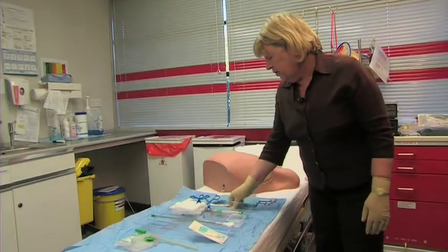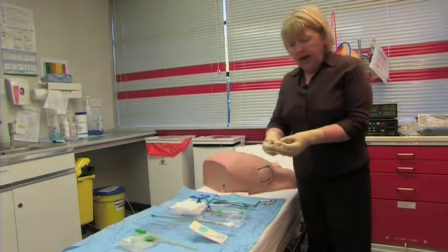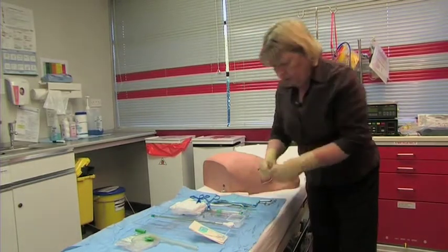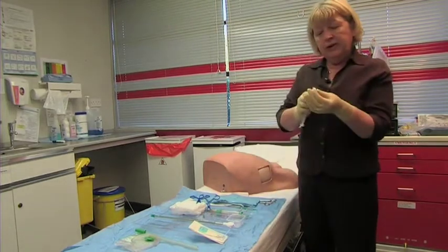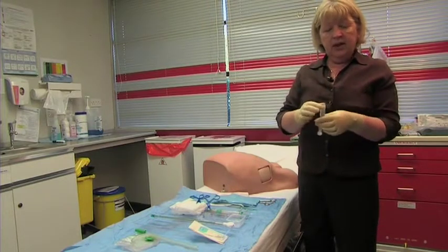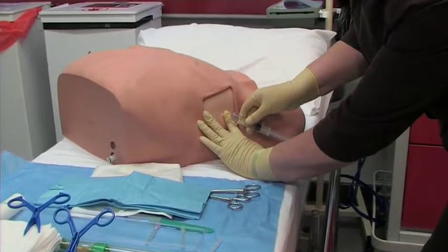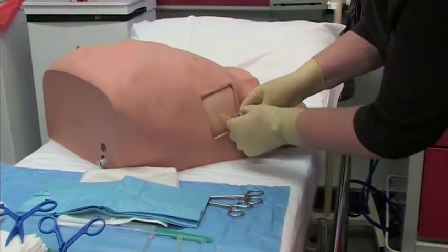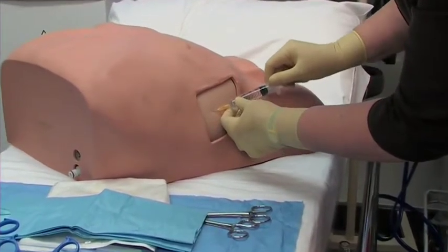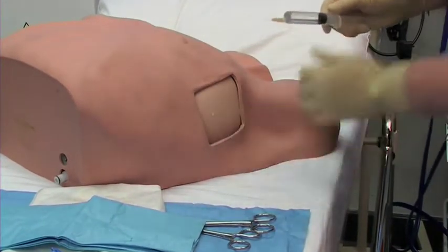The first step is going to be introducing local anaesthetic. In the pack, you will see there are three sizes of needles. The first one is for the superficial skin area. Draw up ten mils of local anaesthetic and attach the smallest of the needles. Remember to put this in very shallow. Draw back to make sure that you're not in a vein, and then just inject gradually a small amount round in a complete circle.